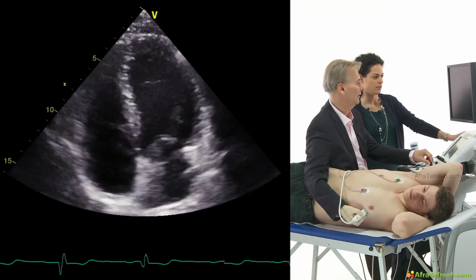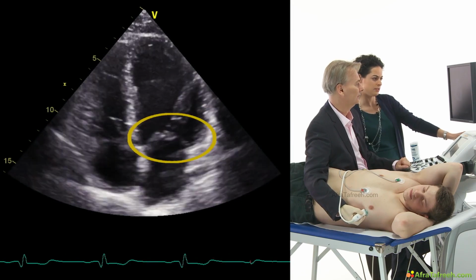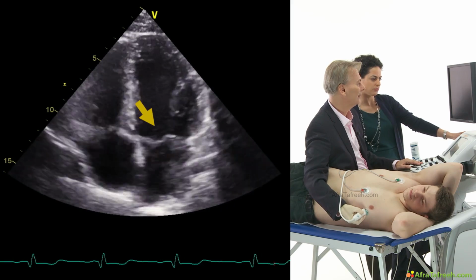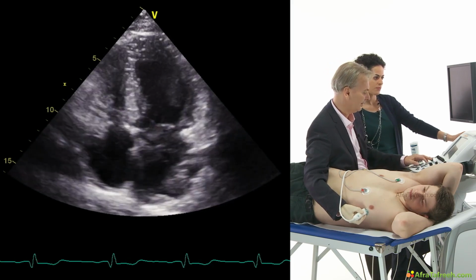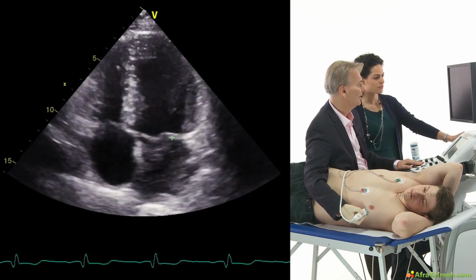This is really nice to see. Again, the mitral valve on the left. Yes, you see the anterior leaflet, which is a bit longer, and the posterior, which is a little bit shorter. Let me show you this. Here, this is the anterior leaflet. This is the posterior leaflet.